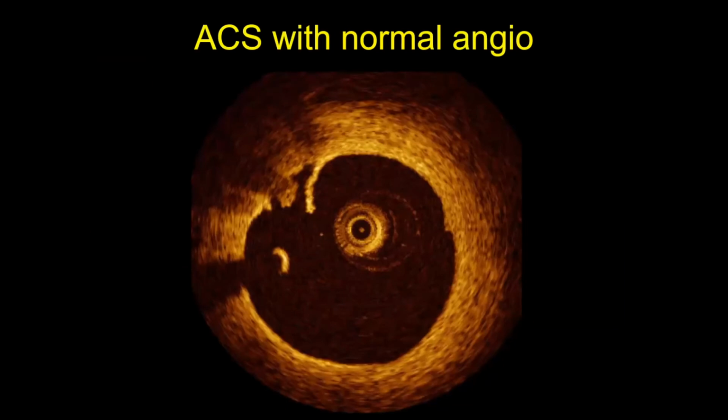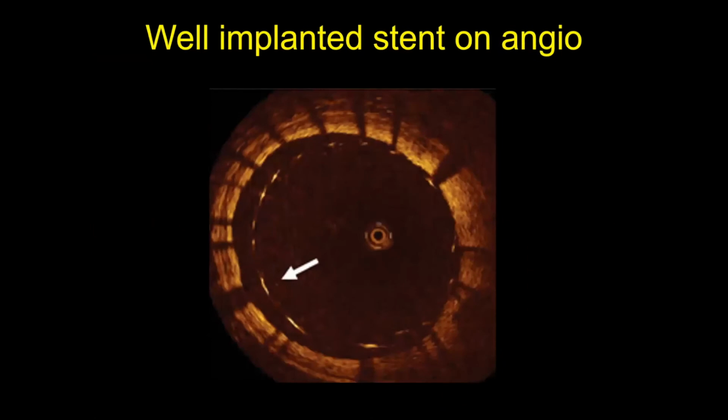Okay, that's another one that Shazia has just said. That's probably one of those. This patient comes in with an ACS. It was a normal-looking angiogram, some concern, and we did the OCT, and I think it's a plaque erosion with a bit of white thrombus attached to it. That was another one where we were happy with the outcome of our PCI. The stent looked nice on angiogram and we were about to finish, but just because we had already had the OCT opened before stenting, we thought, okay, let's do the OCT, and that's what it looked like, and we had to post-dilate it.